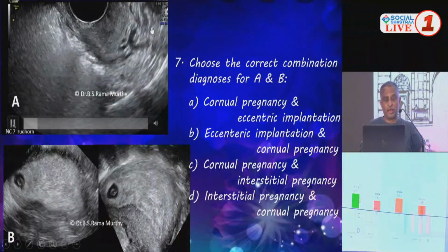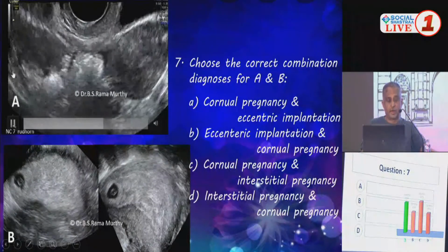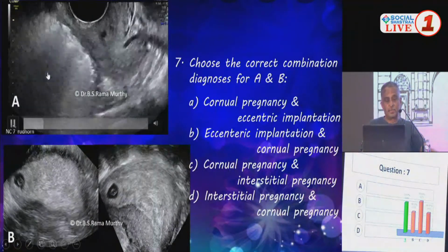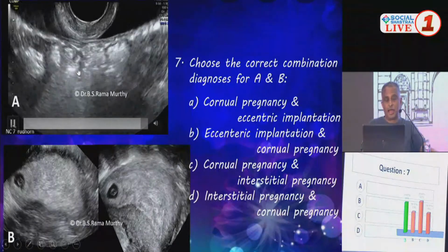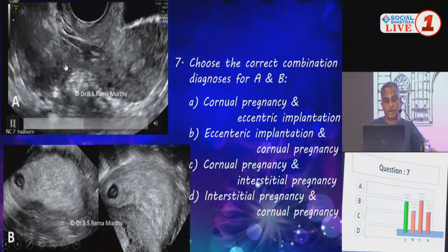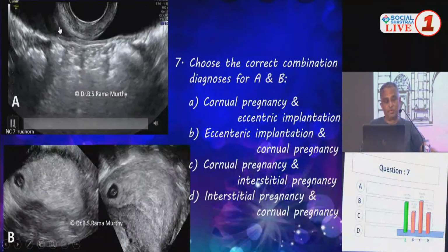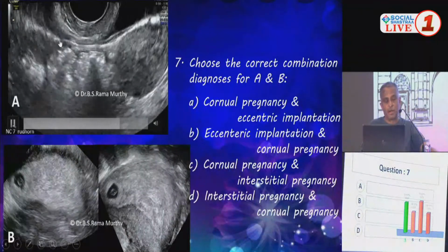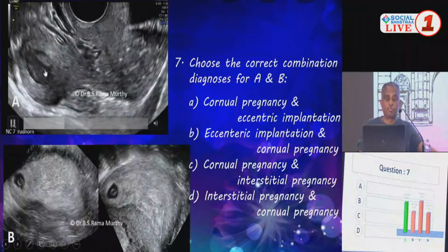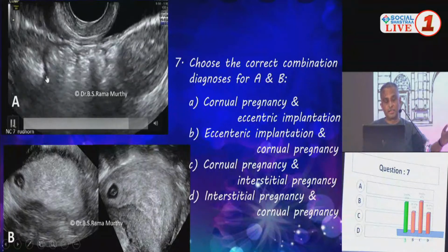Here, you have the left horn of the uterus, which is empty. The right horn of the uterus is gravid. But I cannot call it a horn because the connection is not myometrial. If you notice, it's just a leash of vessels, and then you have this bunch of myometrial wall there. So this is a rudimentary horn of the uterus on the right side, showing you a gestational event inside.